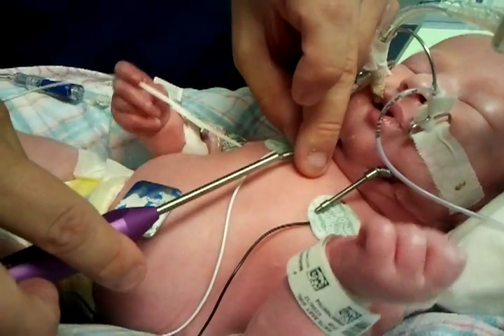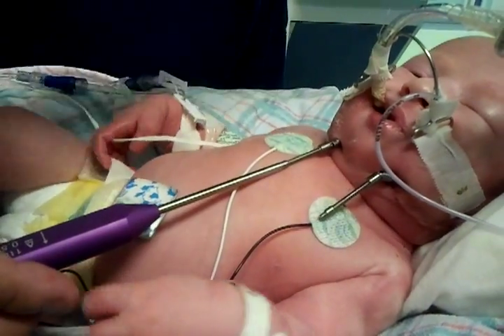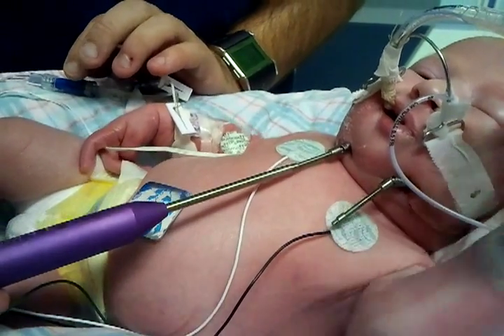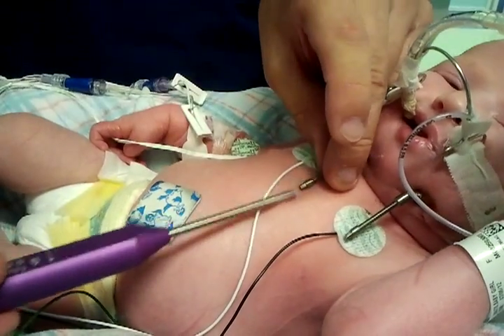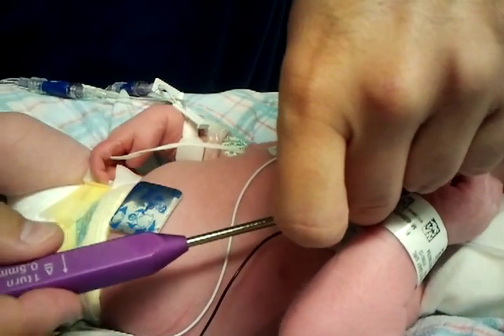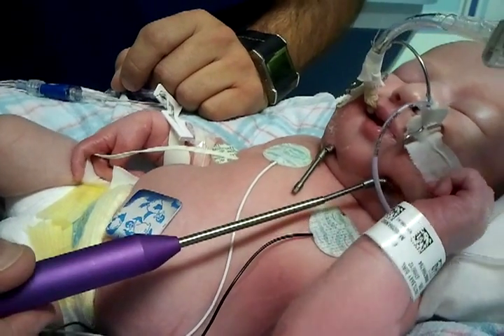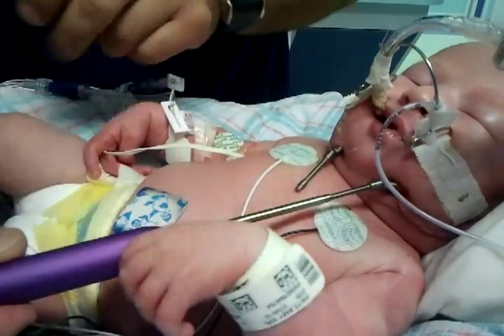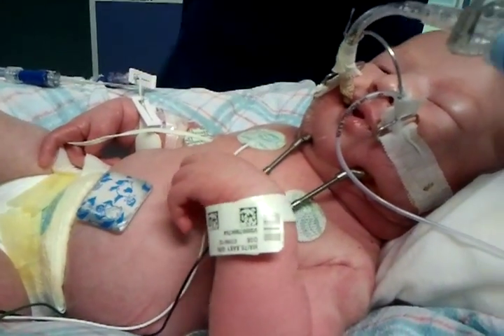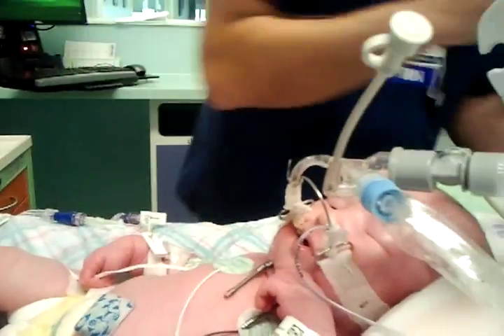You put this on the top like this — that's it. And you start there: one full turn, so when you stop it just clicks, and then you stop where you started. One full turn done. Go to the next one — I'm going to go just a slight underneath that full turn just to get it on the same, because this is a slight bit off. You want it about right — actually it's right there. Again, one full turn. There you go, take it off. Done.